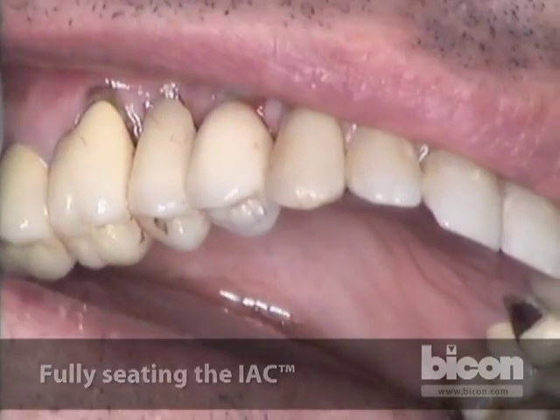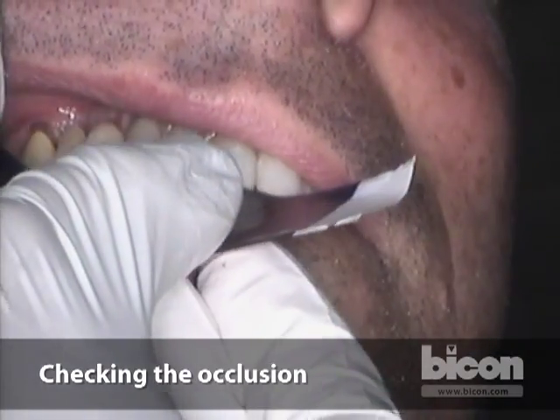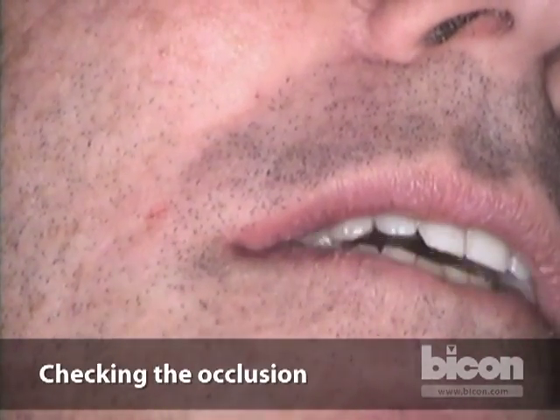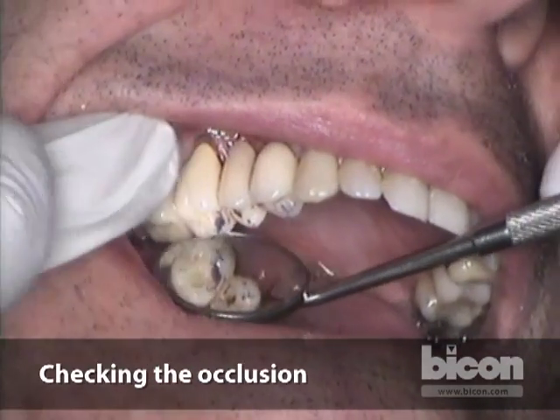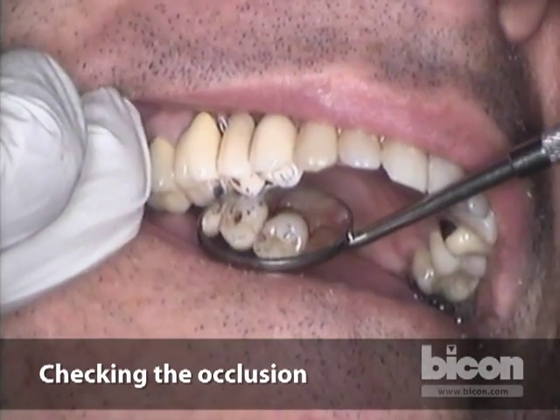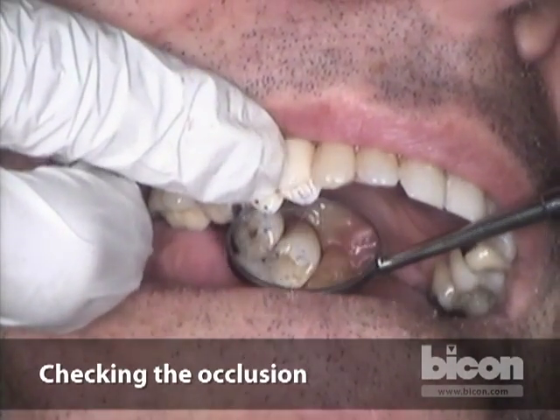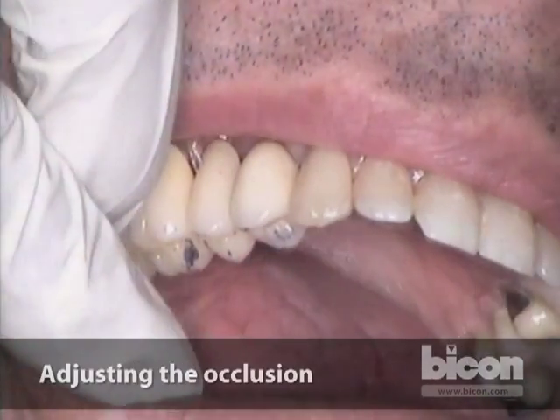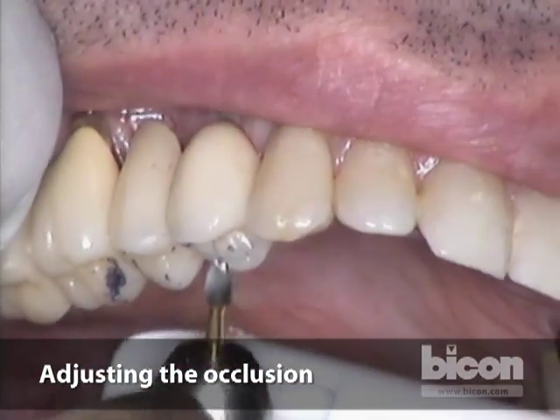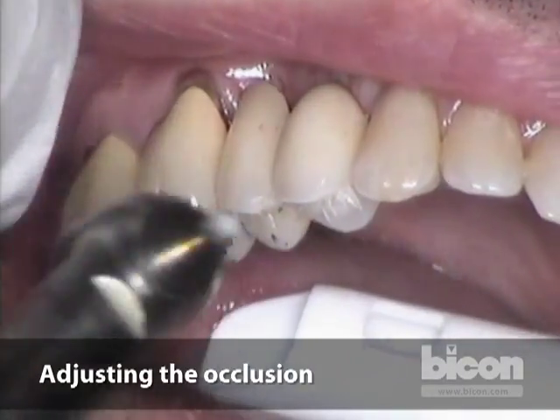Now I'm going to check occlusion. I ask the patient to bite down, open, close. You can ask the patient if it feels a little high or is it comfortable — it's pretty good. We have contact on all the adjacent teeth as well as in the crown. I prefer the contact in the crown to be just slightly a little lower, and I do not like this sliding contact in the lingual cusp, so I'm going to adjust that. Since this is a polyceramic restoration and not porcelain, it is very easy to adjust. I adjust the sliding contact in the lingual and lighten the distomarginal ridge contact.